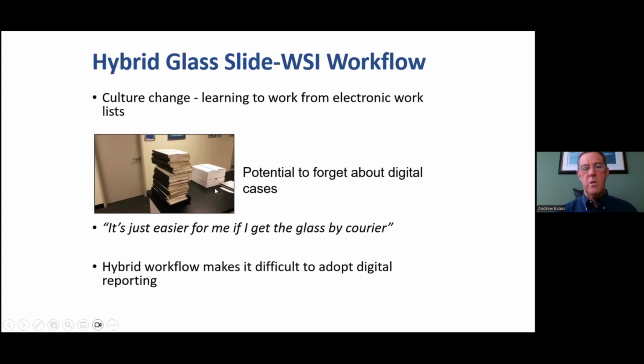So there is a potential when you're working between glass and digital to forget about digitized cases that are in your work list. And what I frequently heard was, it's just easier for me if I get the slides by courier. So you really have to break free of that hybrid workflow in order to complete full adoption.